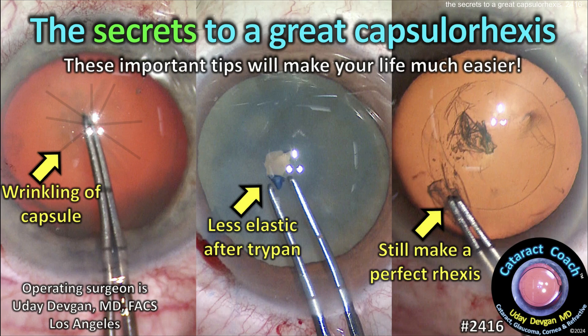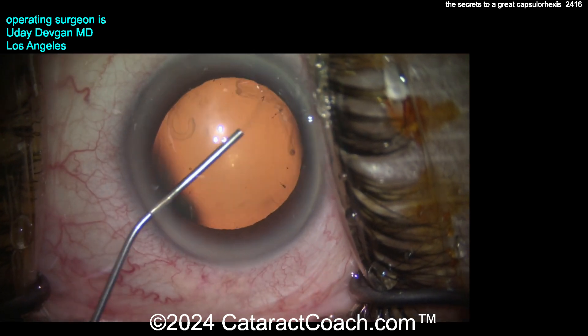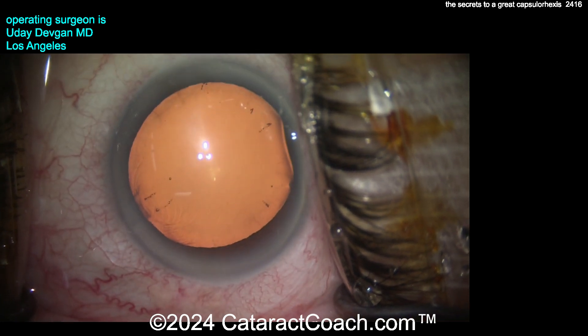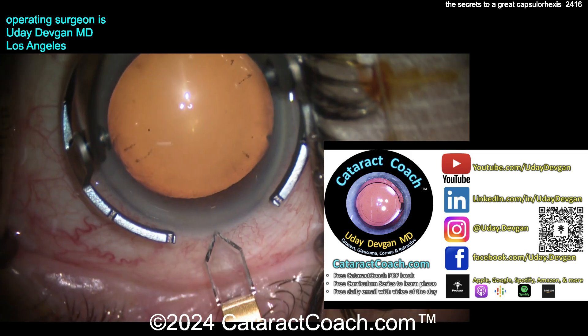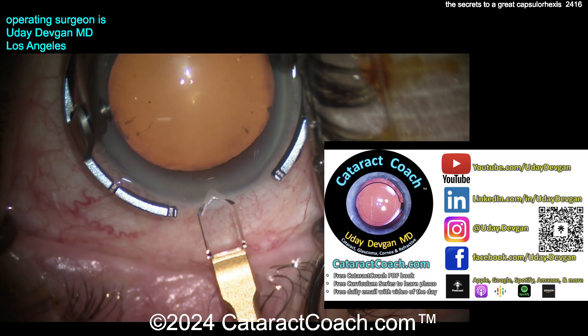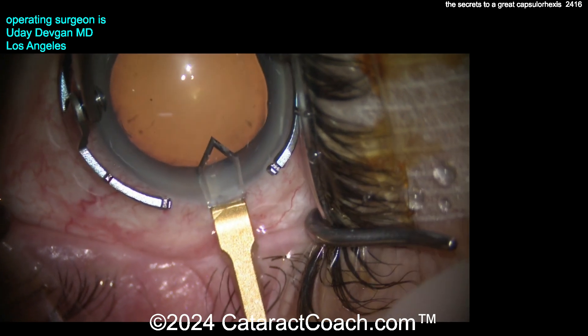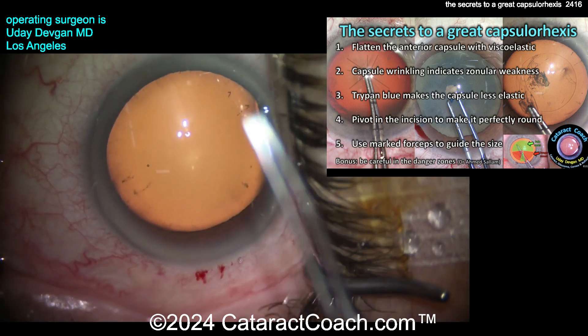cataractcoach.com — the secrets to a great capsulorrhexis. These important tips will make your life much easier. We have a new series called the Secret Series on cataractcoach.com. The purpose is for me to teach you all of the secrets I've learned in the last few decades — secrets your professors won't teach you, and maybe don't even know. We're going to democratize cataract surgery education.